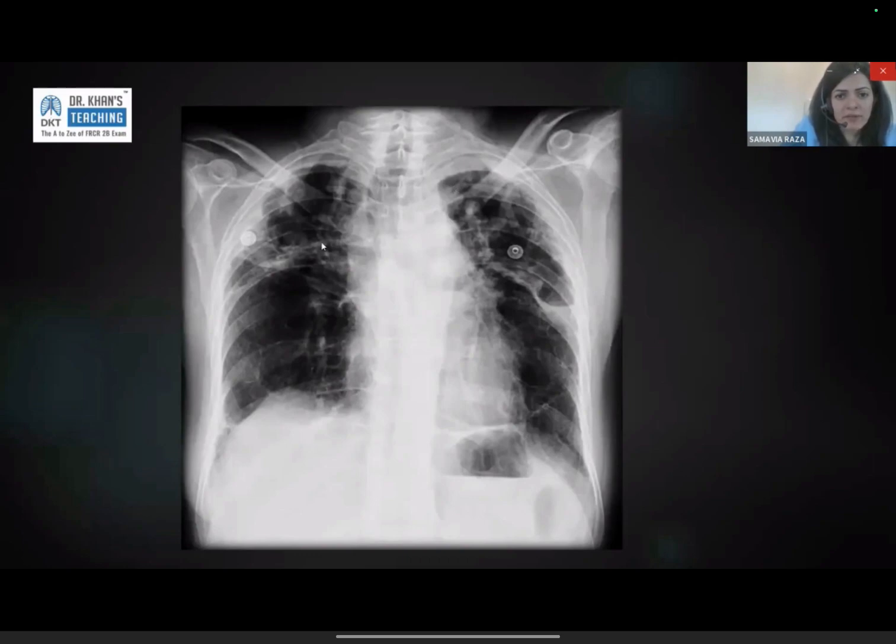Okay, perfect. Thank you. It's great to see all of you engaging with the chat, and all of you are giving very good differentials. Somebody has said advanced hypersensitivity pneumonitis, and I would really encourage you not to use terms like advanced. It's either acute or chronic or subacute. We'll come to HP in a bit, and hopefully by the end of today's session, you will know what to call acute and chronic in terms of HP at least.